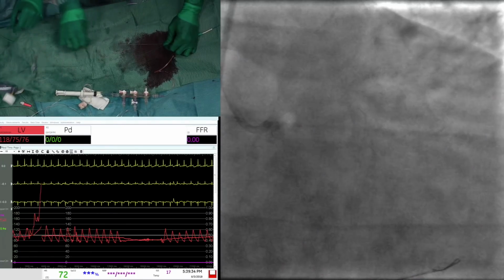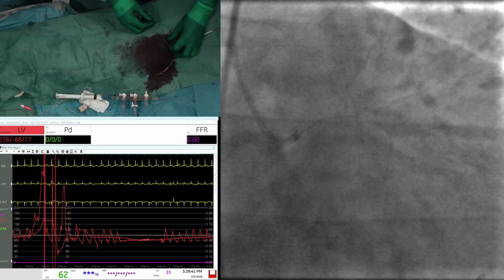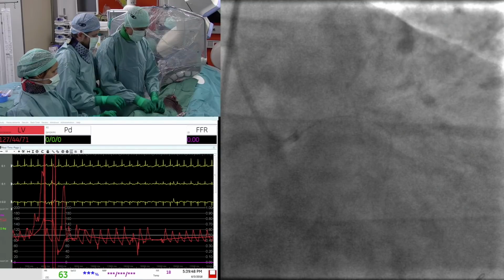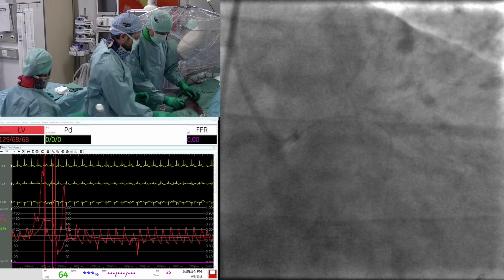So Bernard, just to provide you a wrap-up of the OCT information, the stent that was implanted was a 3 millimeter. Proximal ostial LAD is almost 3.5 millimeter. The left main is completely diseased. We really didn't find any segment where we could visualize the media. And the MLA is less than 5 square millimeter there. So it's really a tight left main disease.